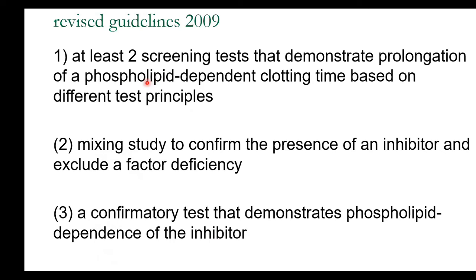But with the two screening tests, you should be able to demonstrate that the abnormal result is because of phospholipid dependence of the inhibitor. And the other is the mixing study, to first of all demonstrate that inhibitors do exist in the plasma of the patient.